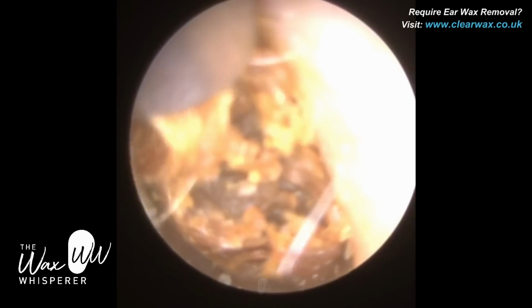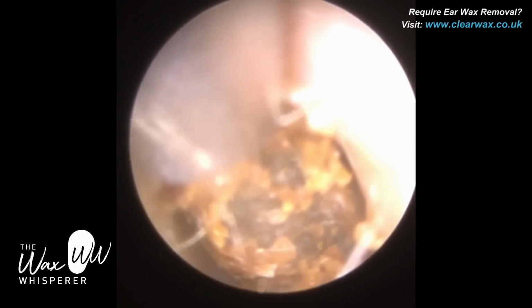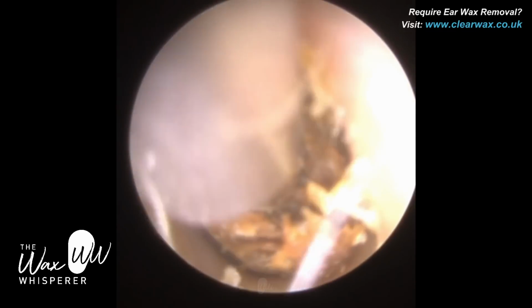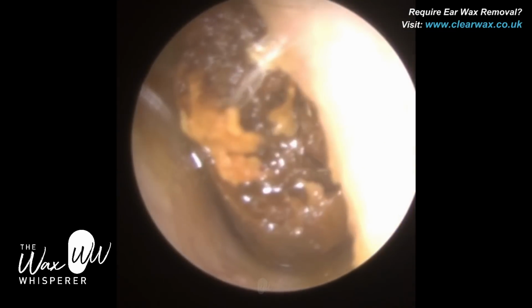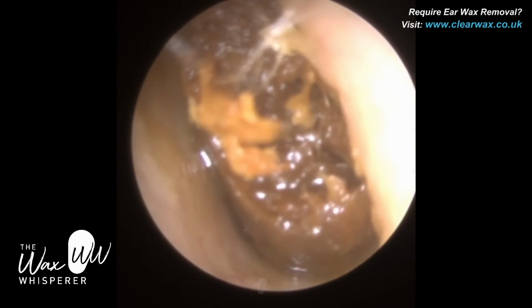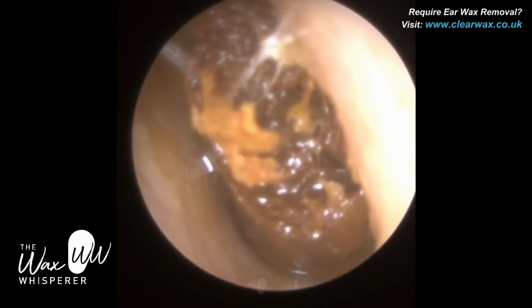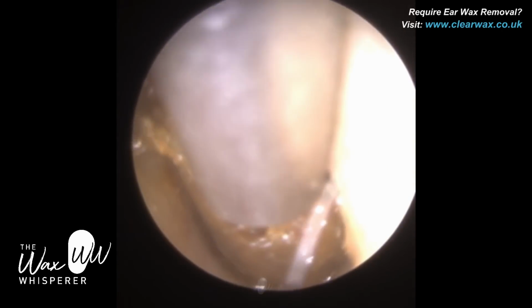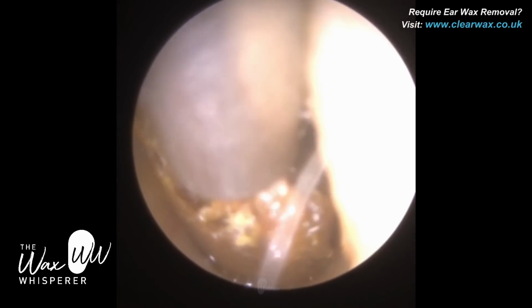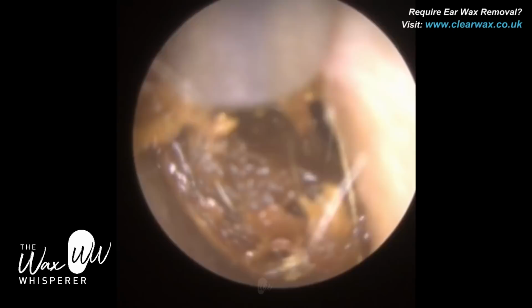I'm just using the Zollner suction probe, and the Zollner suction probe's internal diameter is 2 millimeters, so altogether it's about 2.2 to 2.3, and it just about fits. So the width of this patient's ear canal, I'd say, is about 2.5 to 3 millimeters. So I've just put a little squirt of olive oil spray. You can see it's just a bit wet, and that helps because the wax is quite dry. The oil allows me to get a sufficient suction grip. I'm just wriggling this out.